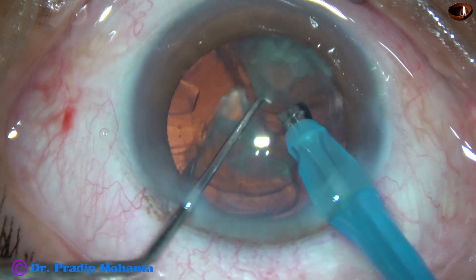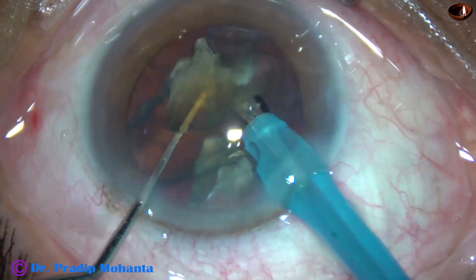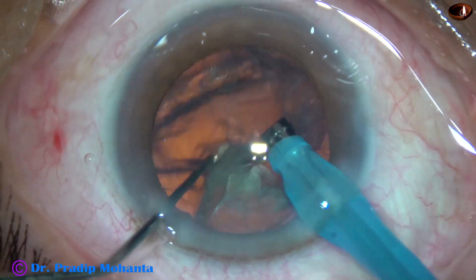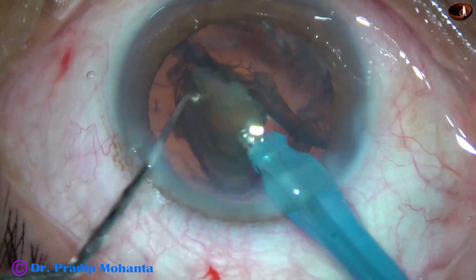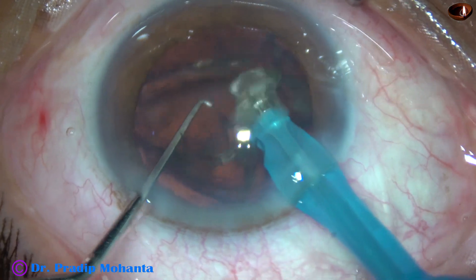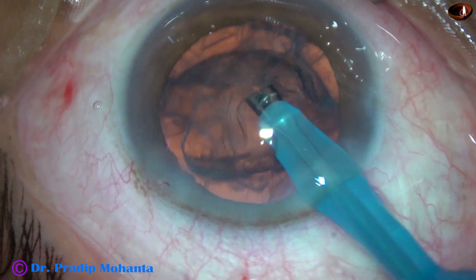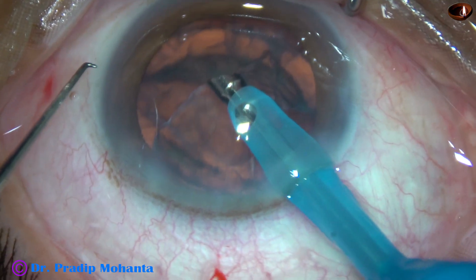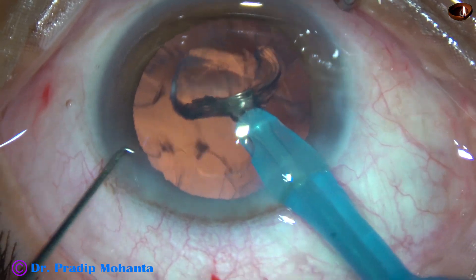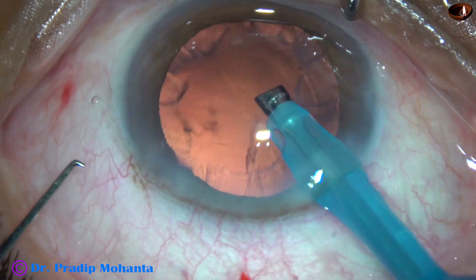This is the last but one nuclear piece. And now the last piece — take the last piece over the epinuclear cushion and emulsify it. Now I am in FACO 3 mode where the vacuum is 200, flow rate is 25, and these epinuclear shells are emulsified.